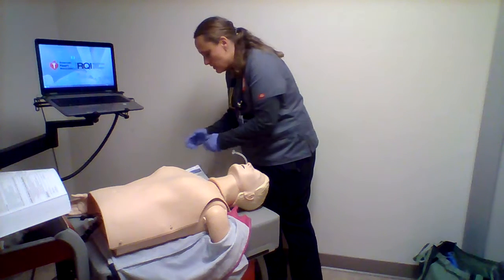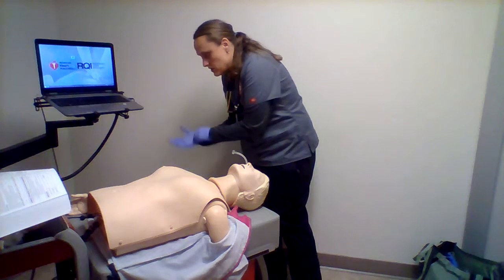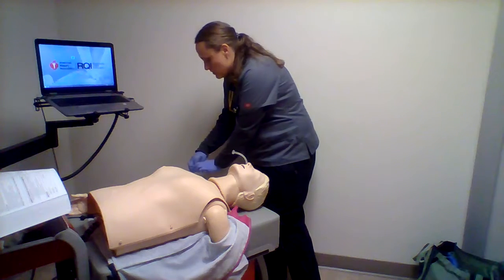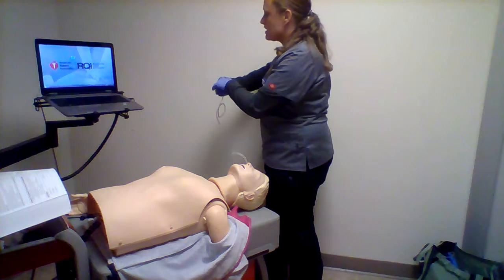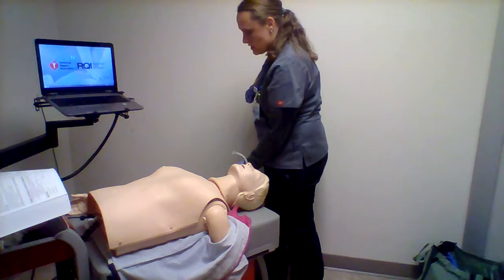This is kind of a sterile field, so these gloves will come off. I would wash my hands and put on these sterile gloves, which is a specific way to do that. I'll crack my port very carefully, connect the tubing, and verify that it's suctioning with the water. It is suctioning.